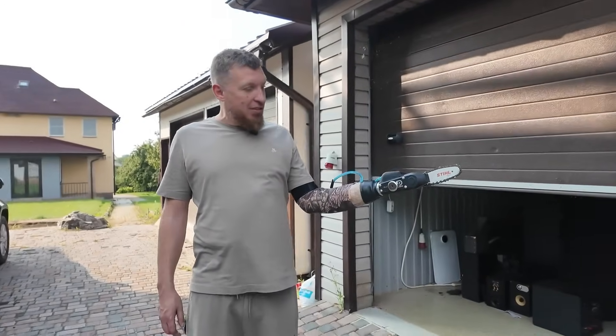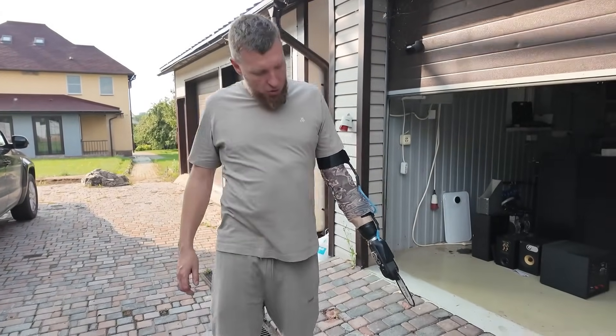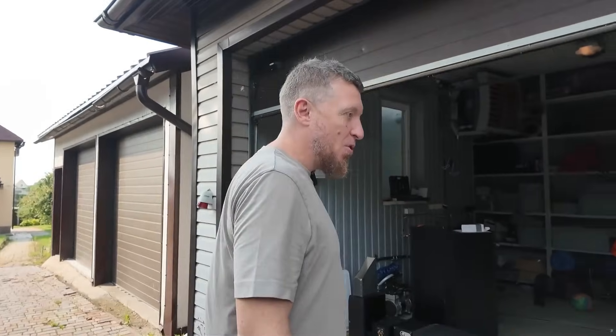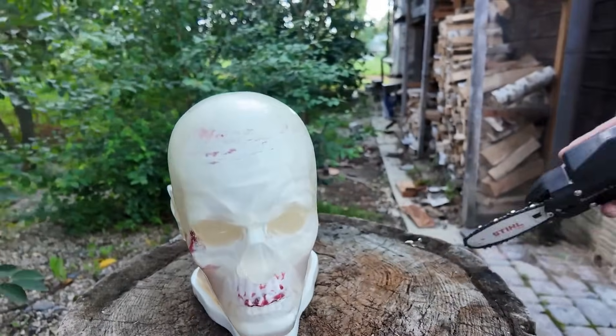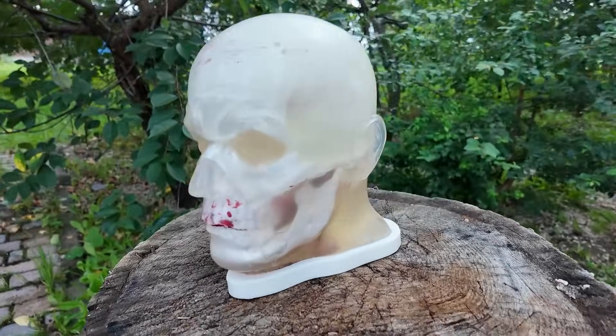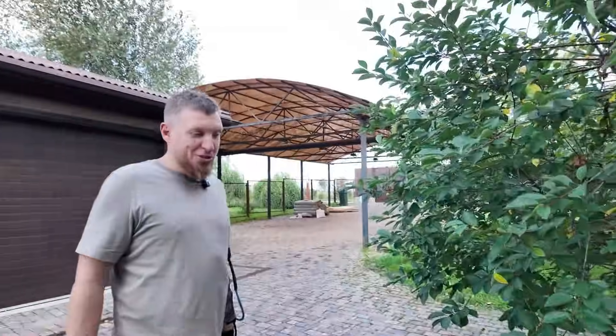Actually, if I change the chain I could trim trees in the spring. By the way, it turned out to be pretty light. There's a bigger electric saw but I think that one would be too heavy. Shall we try it now? Gentlemen, let's imagine this is an Evil Dead — let's try to saw it.